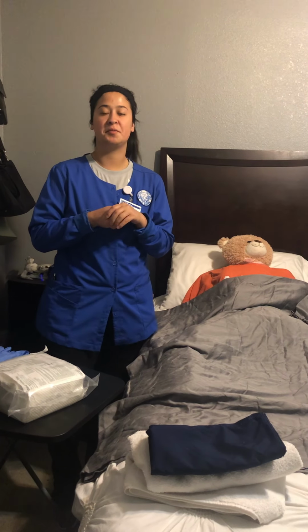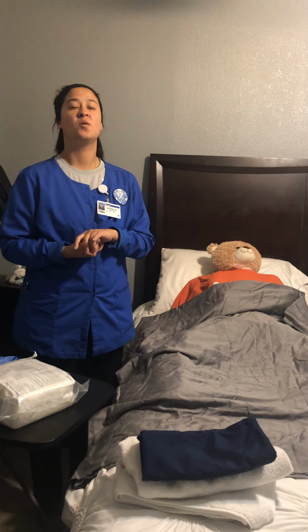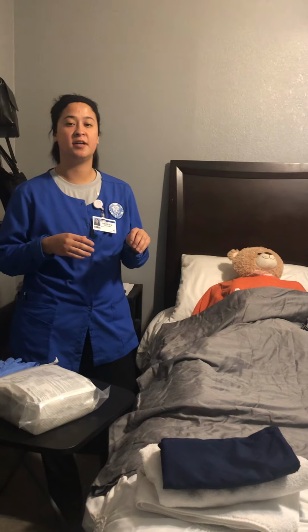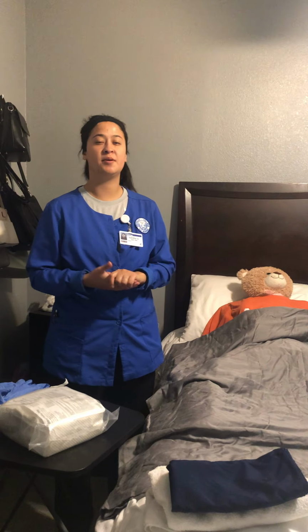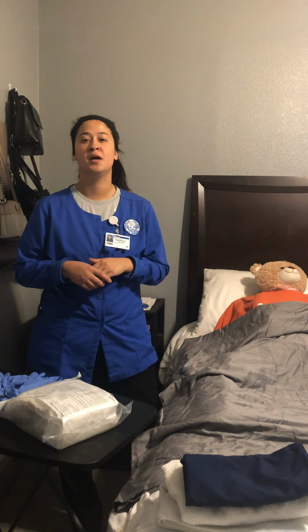Today I'm going to be performing my catheter insertion skill. I would first start by verifying the doctor's orders. Once I did that, I would then look into my patient's medical records, seeing if there's any urinary strictures that would cause any complications when I place the urinary catheter. I would then go into my patient's room, close the door to ensure privacy. I would perform hand hygiene.